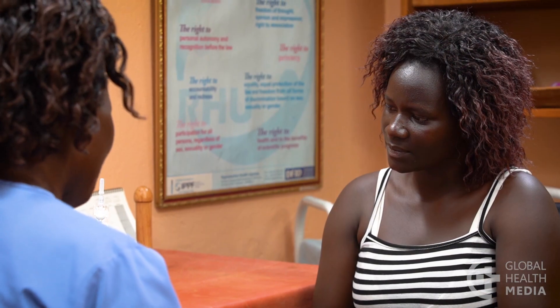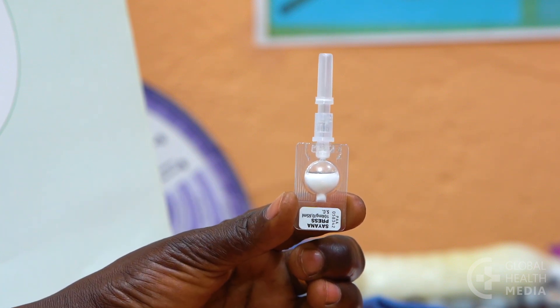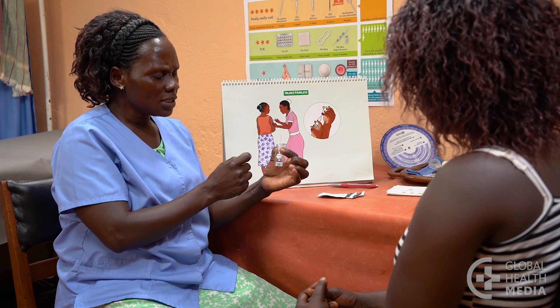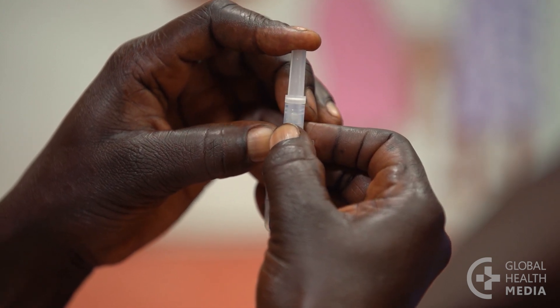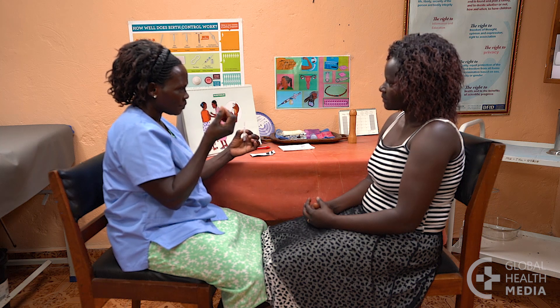Tell her it's normal to have an air bubble in the reservoir. Then close the gap: hold the device by the pot with the needle pointing up, and push the cap and the pot firmly together to close the gap. Now the injection is ready to use.